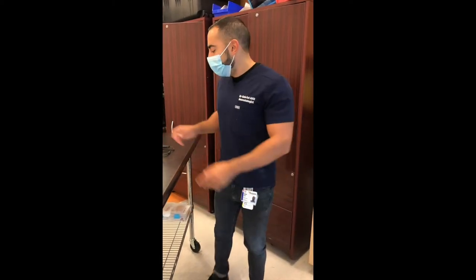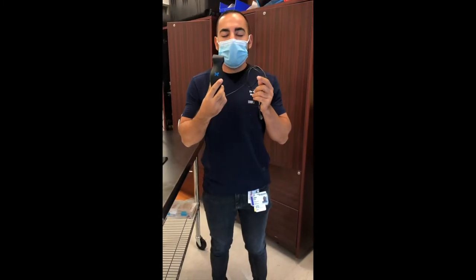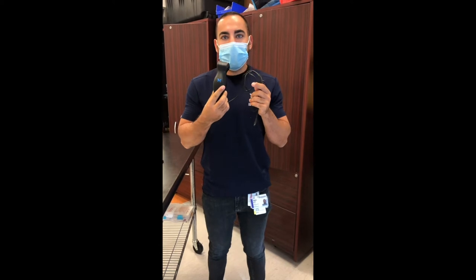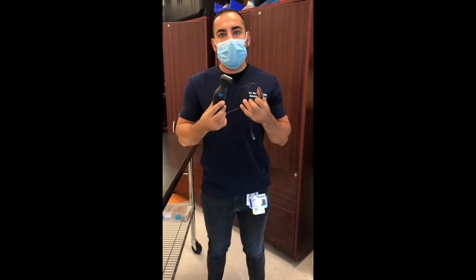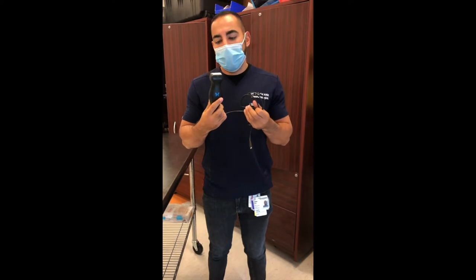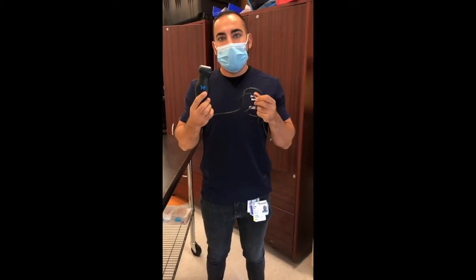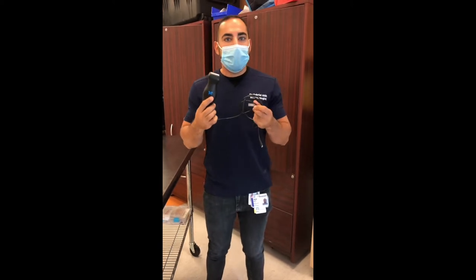Hello everyone, my name is Gabrielle Altit. I'm a neonatologist at the Munchell Children's Hospital. Today we will be going over how to use the butterfly ultrasound, which is a handheld ultrasound that can be used in neonatology for heart imaging, lung imaging, and brain imaging. Today we'll be going through some of these modalities, how to plug it, what kind of material, and the images that can be acquired.